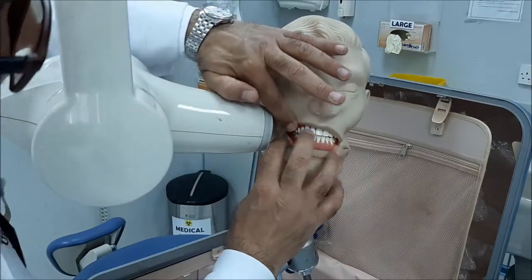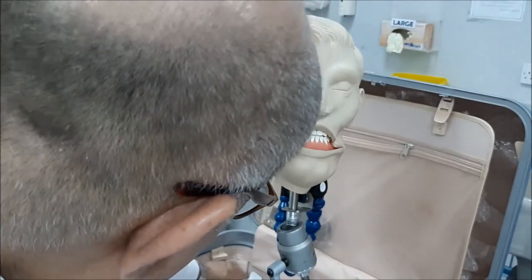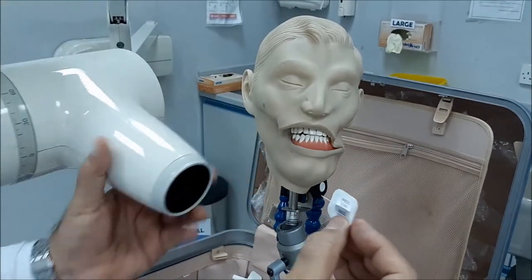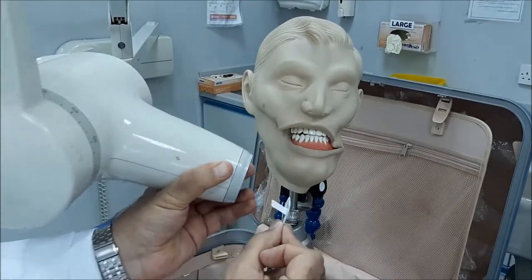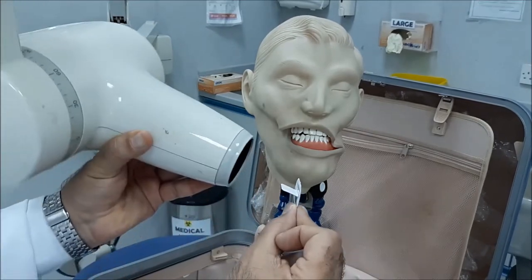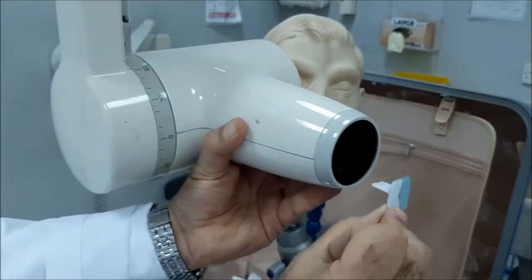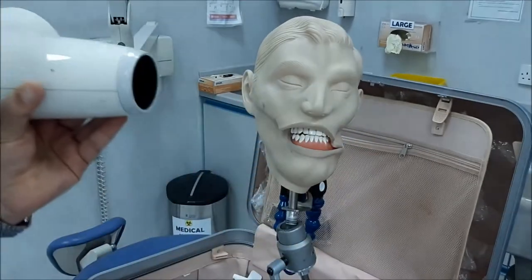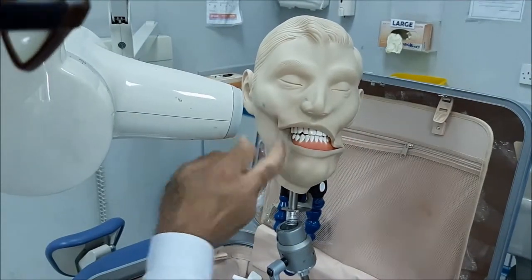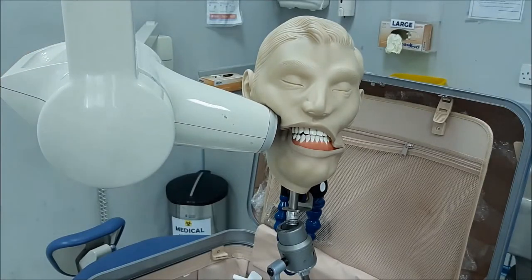Next, make sure the film is completely covered. This is done by reflecting the cheek and trying to make the margin — the tab of the film — in the center of the cone. The horizontal angulation is adjusted by this movement, and you direct your beam so the coverage is in the correct position. Search for the free margin extending, then center it within the cone to guarantee the whole film is covered.